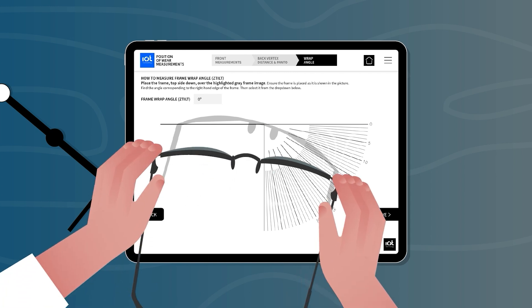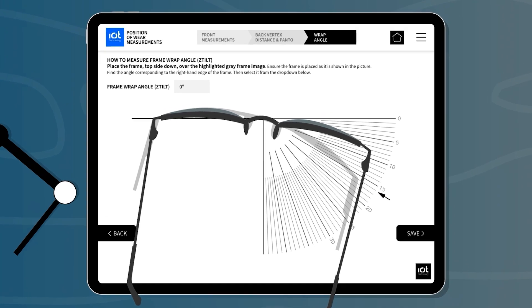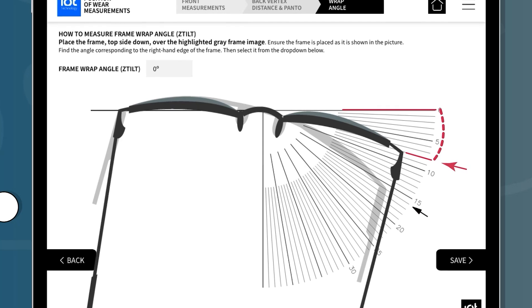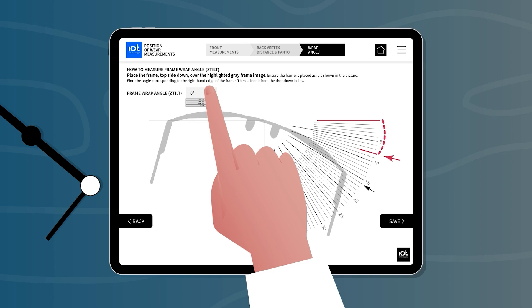Finally, place the frame over the gray outline to determine the frame wrap angle. The frame should be placed lower edge down with the left-hand lens on the horizontal line. Find the angle corresponding to the edge of the right-hand lens and enter it into the drop-down box.